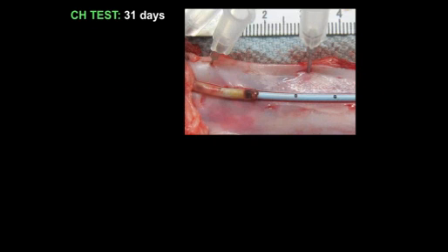But let's look at another, because I don't want to leave the impression that they all look like that. The others did have some fibrin sheath, but they were very short. Now this one is interesting because, again, you see the chronicity and the transformation from cellular to non-cellular. And also you see the more acute formation, meaning that these sheaths and thrombosis can extend.